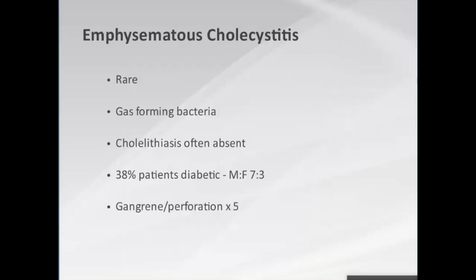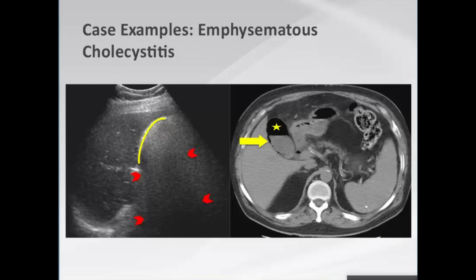Emphysematous cholecystitis is thankfully rare, caused by gas-forming bacteria. Often gallstones are absent; a little over one-third of patients will be diabetic and it is more common in men. It is an important condition because of its high gangrene and perforation rates and therefore high morbidity and potentially high mortality. We see a very echogenic gallbladder wall with reverberation artifact — so-called dirty shadowing — very typical of air in the gallbladder wall.